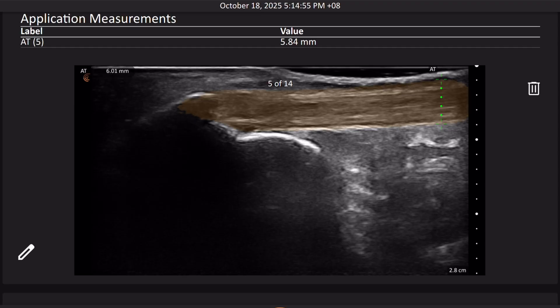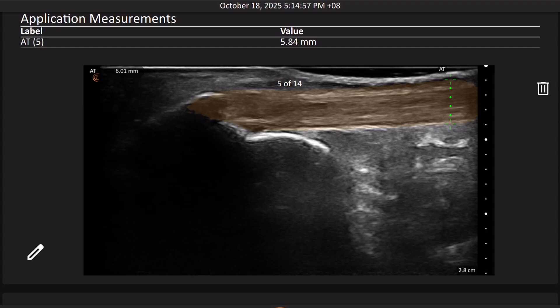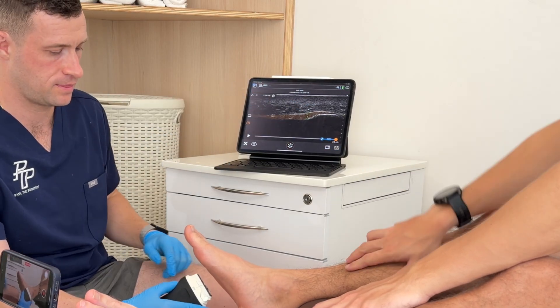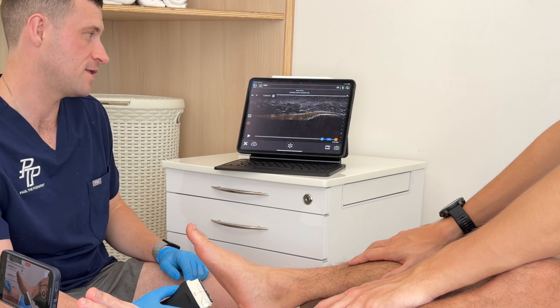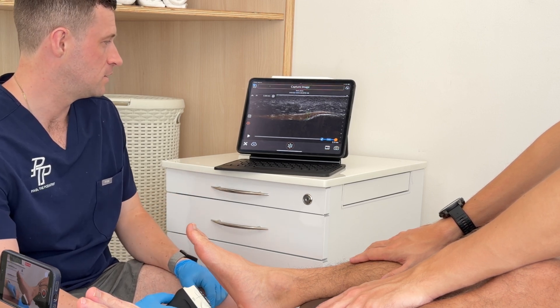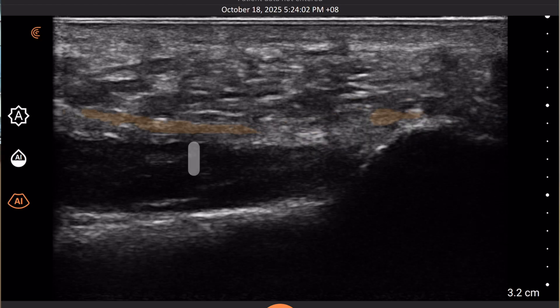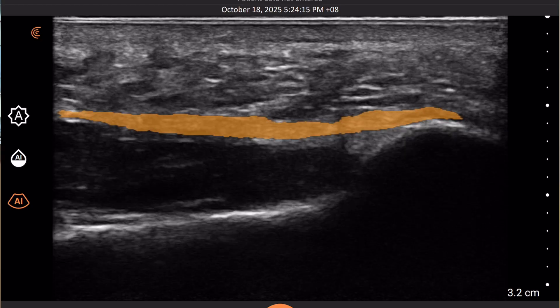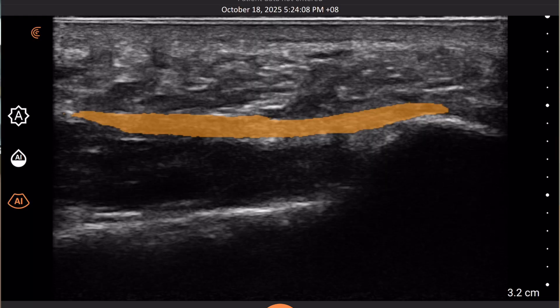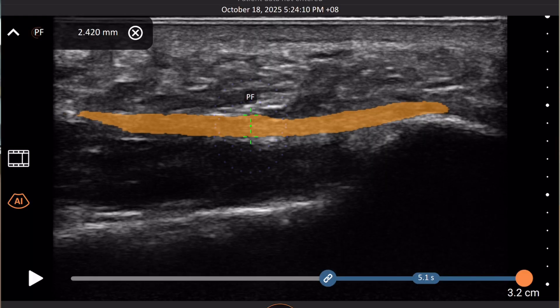Highlighting the tendons for the patient to see makes it really easy for education. Sometimes when you're pointing at the screen without AI mode on, they can be like, oh, I don't know what I'm looking at. But when it's highlighted, it's clear exactly what it is. You can make the orange color deeper so they can see it clearer, or bring it back so they can still see the tendon underneath. And it'll automatically take the thickness, which I think is a fantastic addition.